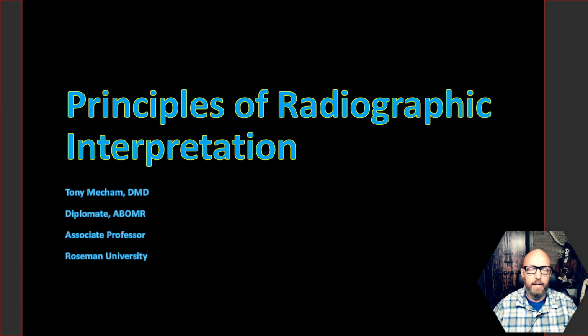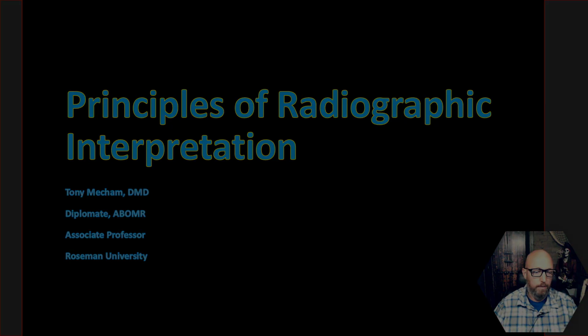So hopefully at the end of this lecture, you'll be able to at least describe things. That's kind of the main focus of this lecture. And to describe it, that's what leads you into that differential diagnosis. So we'll talk about what radiographic signs really point toward malignancy versus benign things, and so on and so forth.